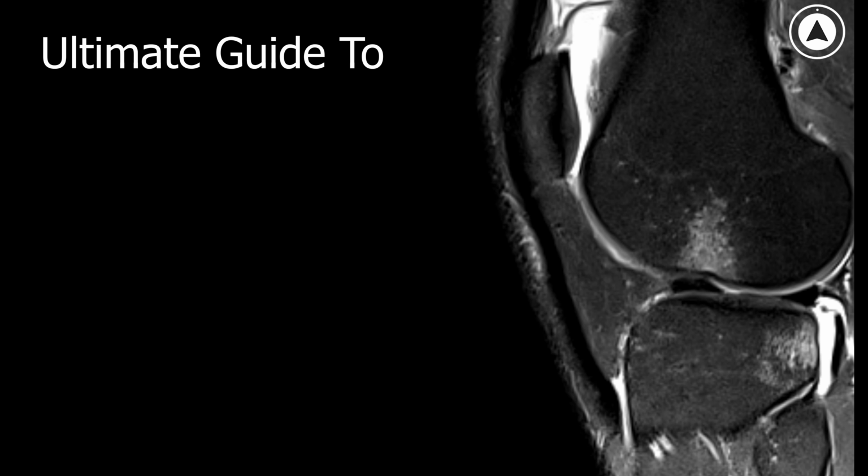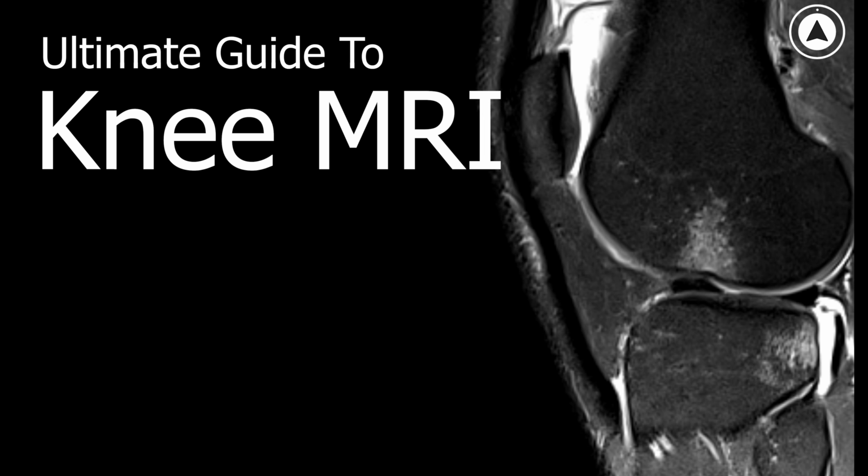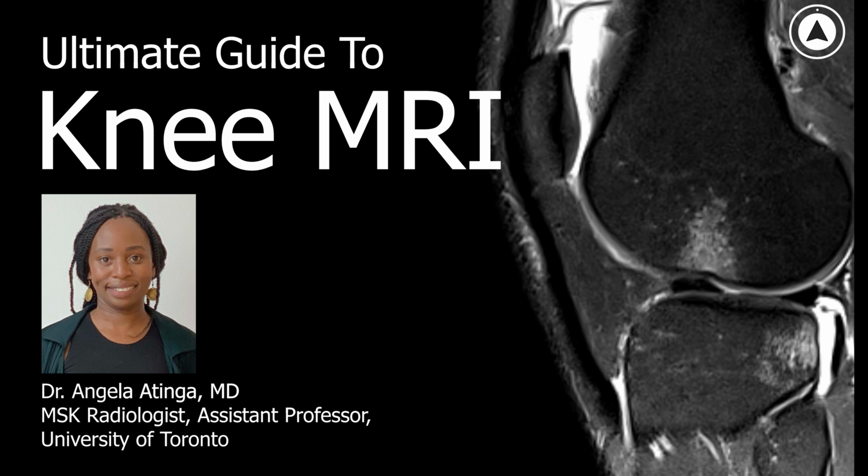That is why we created this video, your ultimate guide to interpreting knee MRI, led by Dr. Angela Atinga, one of the best MSK radiologist teachers I've ever met. She trained at Cambridge, Imperial College in London, completed 2 MSK fellowships in Toronto, and has won many teaching awards for her clear, structured approach.